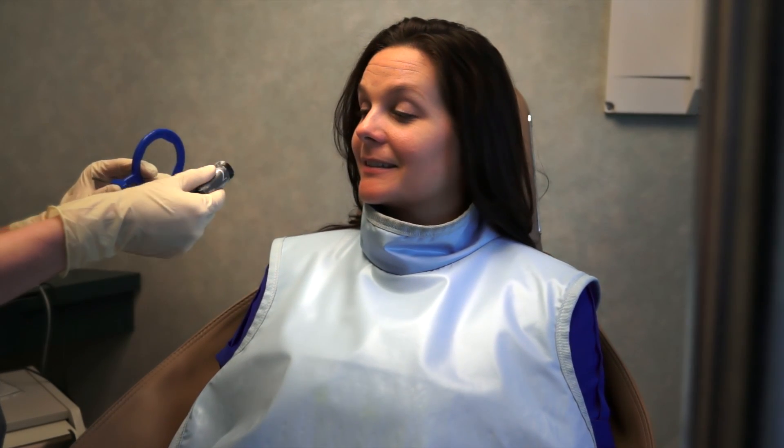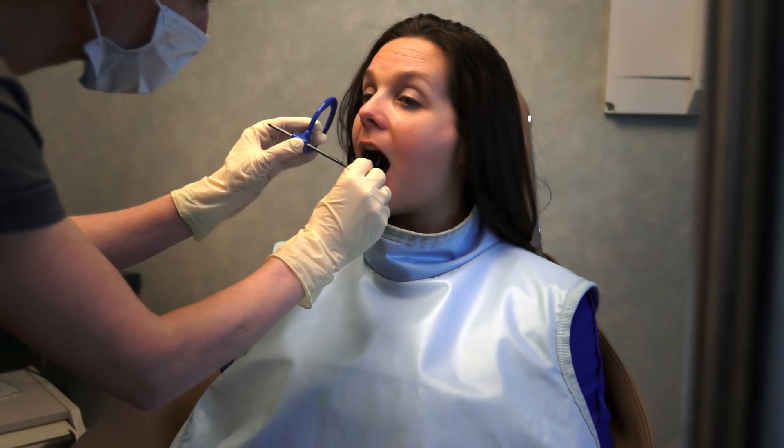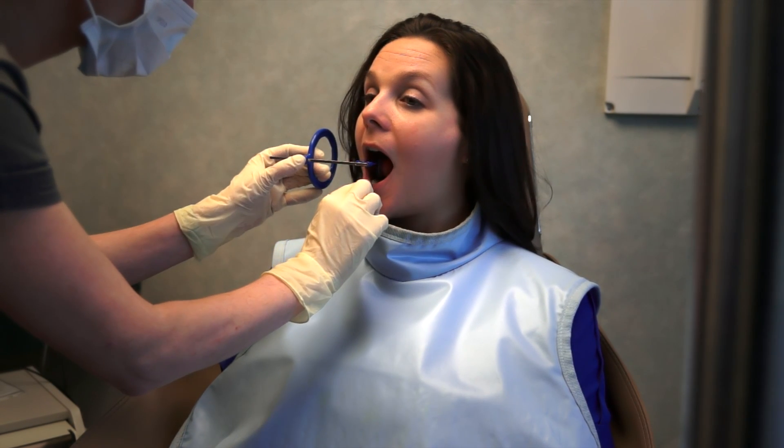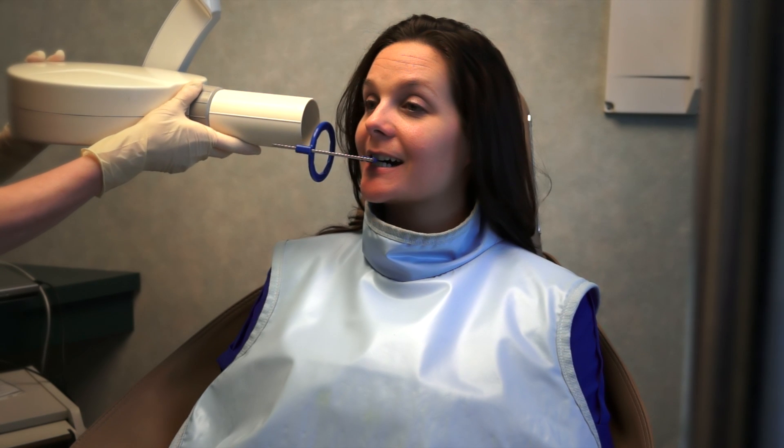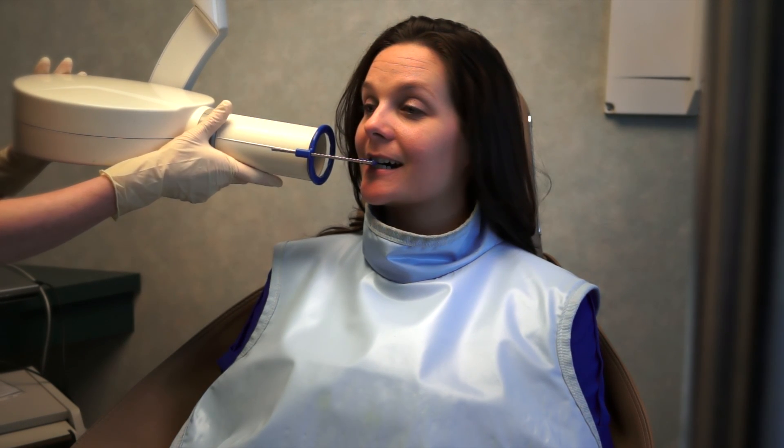The patient is ready to have the radiograph taken. The sensor is placed inside the barrier, inside the x-ray positioning device. It can actually be bent a little bit to make it more comfortable inside the patient's mouth. It is positioned for the appropriate radiograph that is about to be taken, and the x-ray unit is placed around the ring. We see a close-up of how comfortable the patient is and how closely the teeth can be closed in order to show all the coronal and as much radicular information as possible.